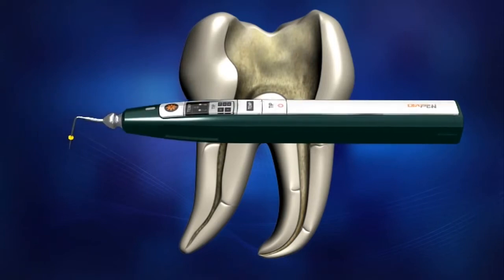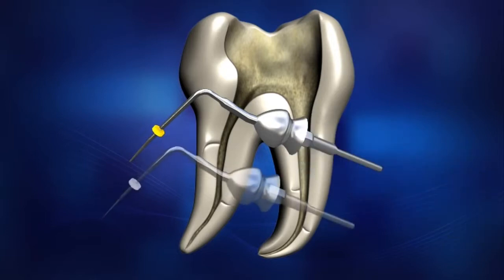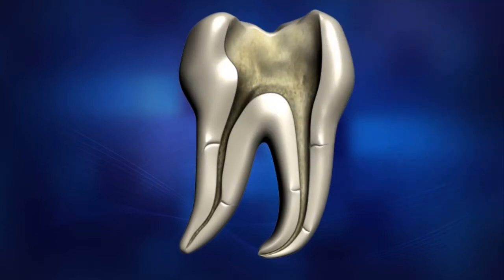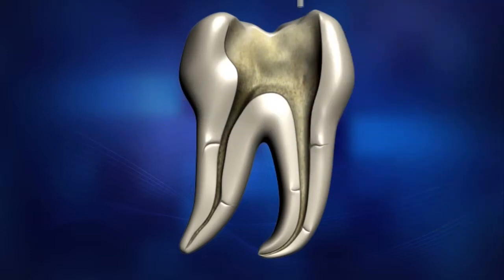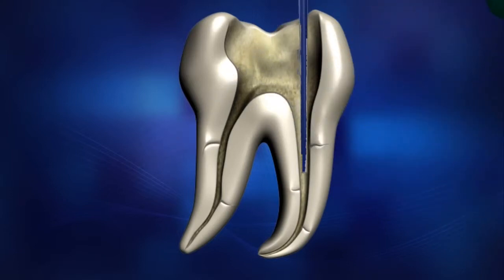It is very important to select the appropriate Diapen tip that most closely matches the size of the prepared canal. To select the appropriate tip, try inserting each size tip one by one. The purpose of this is to measure the length of the canal. Select the largest tip which can be inserted 3 to 5 millimeters from the apex. Once the appropriate tip is selected, move and set the endo stop according to the measured length.